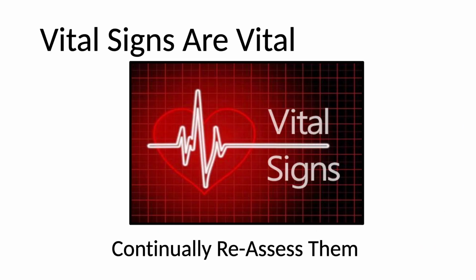Just remember, vital signs are vital. Please, before every procedure or anything that you do, get a set of vital signs going in, and then a repeat set of vitals after you have completed your intervention. Especially with any kind of airway management, end tidal is going to be the key to everything that you're doing, so make sure you're monitoring that and keeping a close eye on the saturation. They can change very quickly, so make sure you're constantly reassessing them.